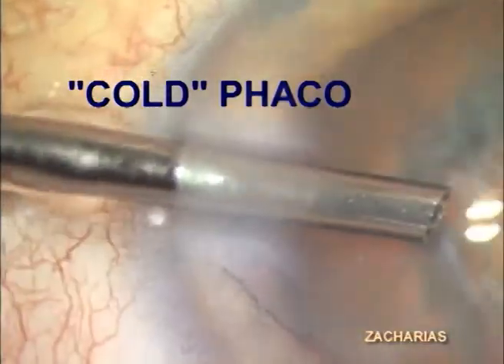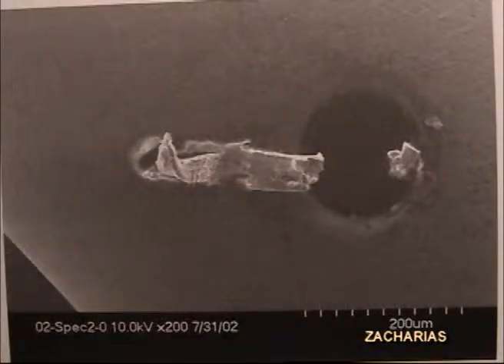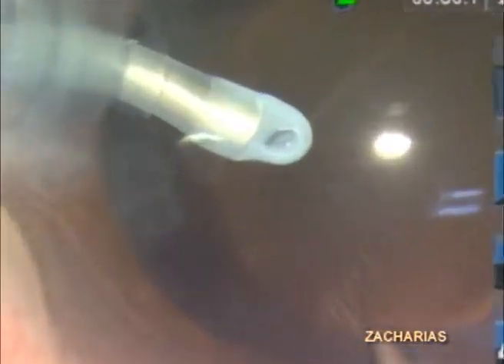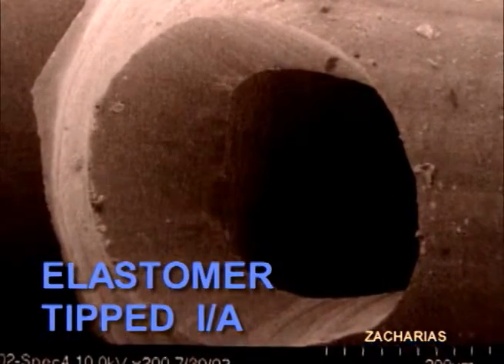In the meanwhile, ultrasound has proved safe for the endothelium and less prone to produce thermal injuries, covering the full spectrum of cataract densities. Close contact of the lens capsule with any metallic instrument, even blunt, may promote rupture mainly by the presence of tiny burrs and spurs. It has been demonstrated that the posterior capsule will withstand maximum vacuum without rupture when aspirated with an elastomer-covered IA instrument. Supposedly, ultrasound would not traverse such elastomer layer in an efficient or harmless way.